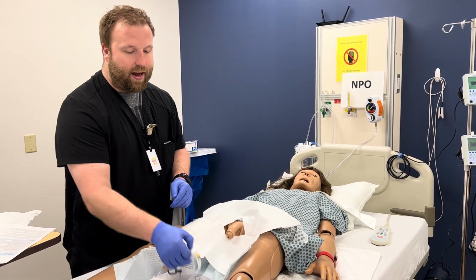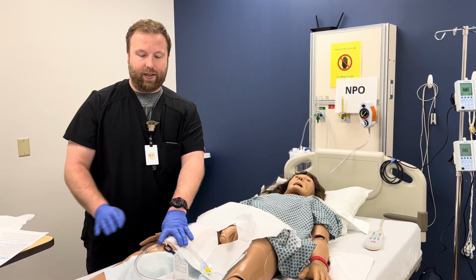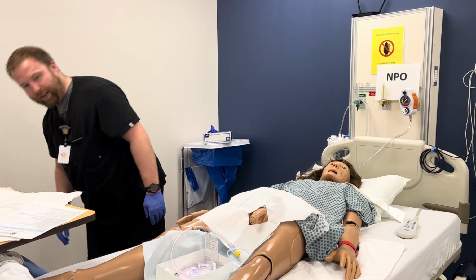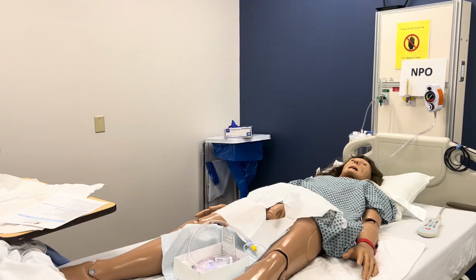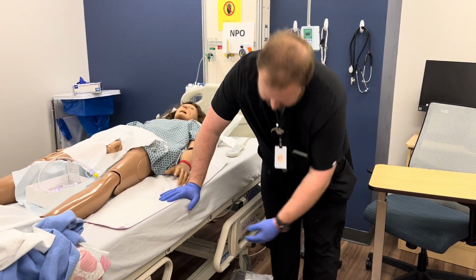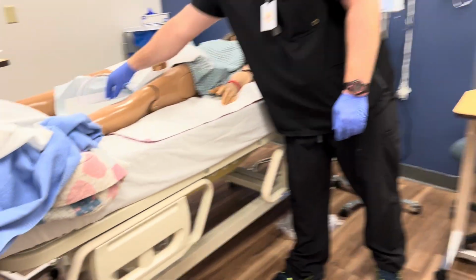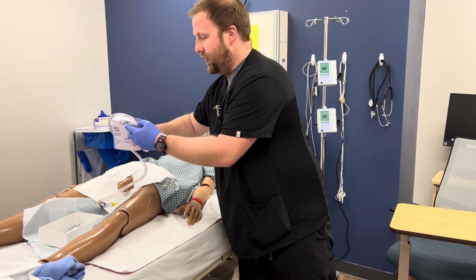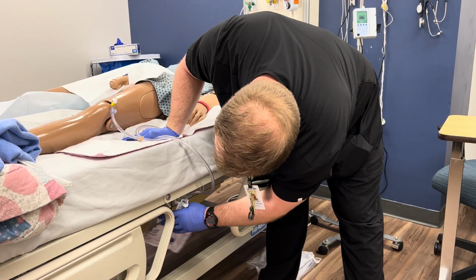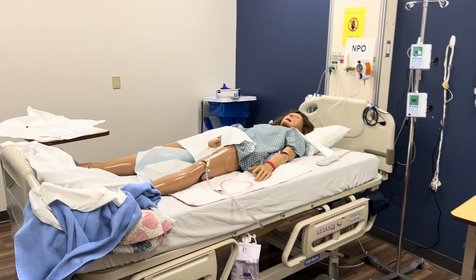Then, after that, I would take and secure this to the patient's thigh there, probably with tape. And on the side of the bed rail, well, not bed rail, but you should have these little things here. They're non-movable parts of the bed. That's where we would hang our bag. You want to avoid using the side rails because those can cause tugging at the catheter and causing trauma to the bladder.